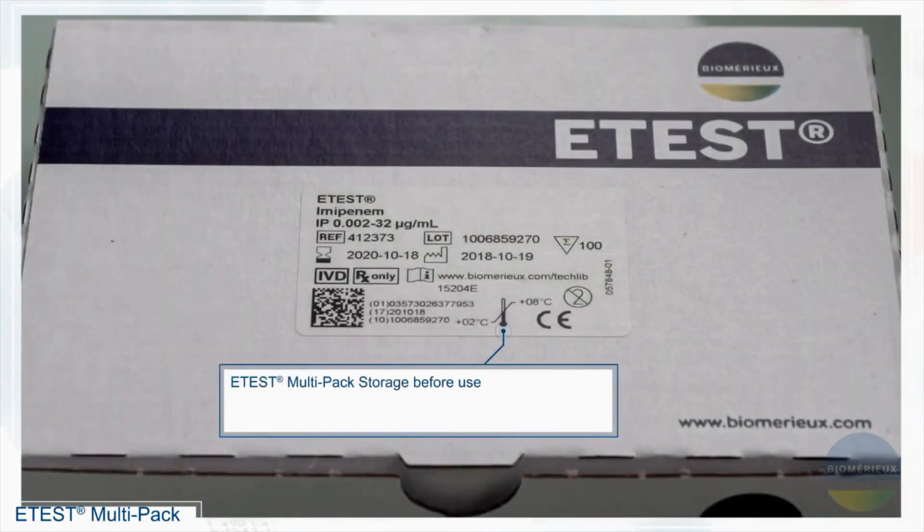eTest multipack storage before use. Store unopened cartridges according to the temperature specified on the packaging.